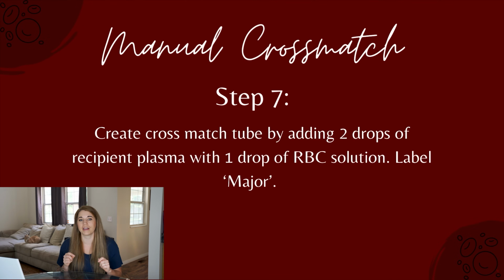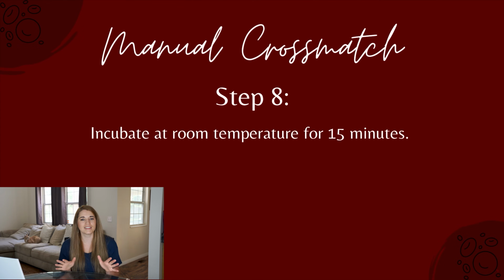Step 7, create your cross-match tube, label it cross-match or label it major, or label it something that you'll know what it is, and add 2 drops of recipient plasma with 1 drop of donor 4% red blood cell solution. Step 8, this is the easy step. Set your tubes down at room temperature and incubate them for 15 minutes.